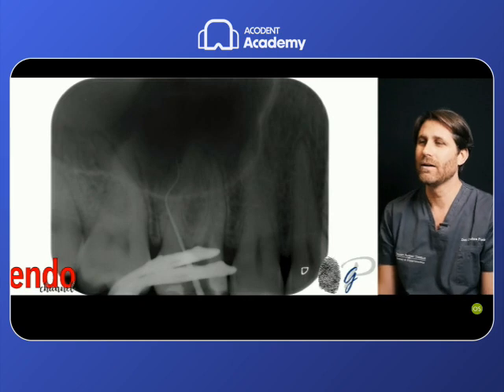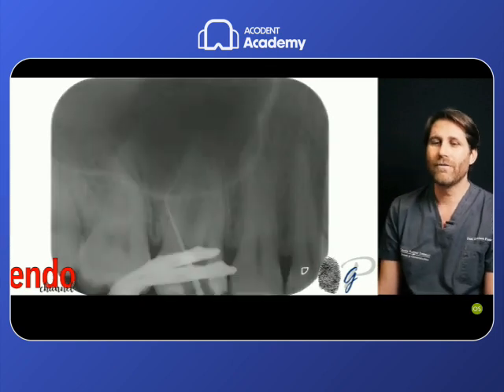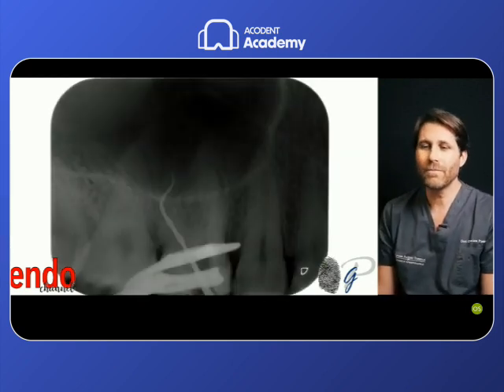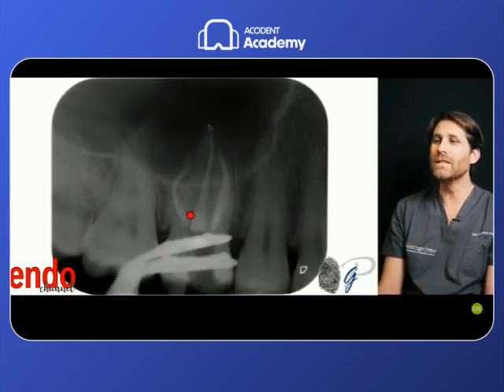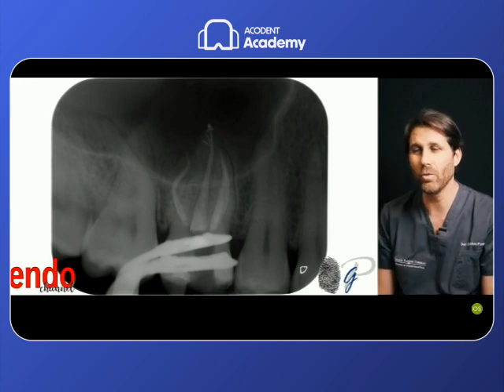Another similar case: first file, file in the middle, file for the preparation, and final obturation of this double curved root canal, very difficult to be treated.